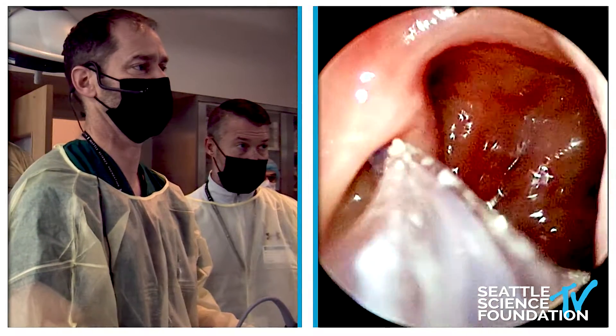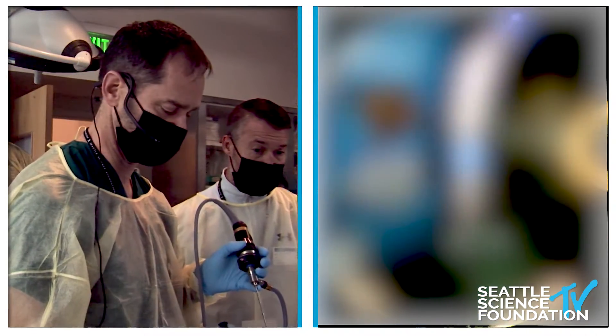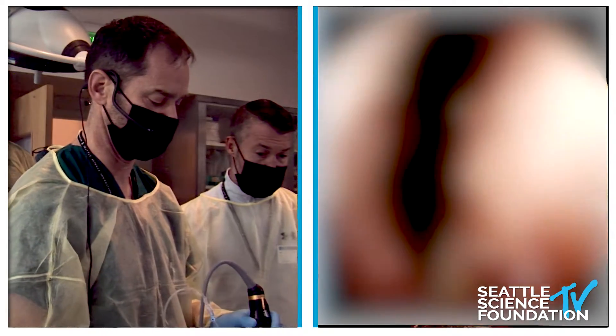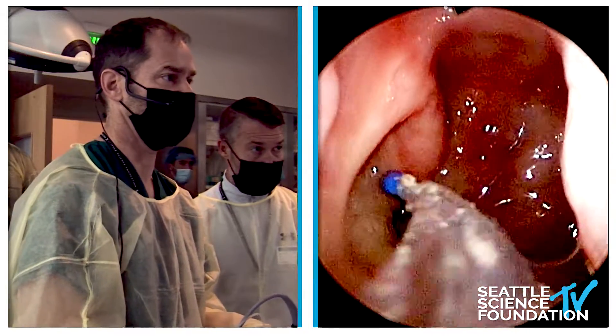This is just finding the eustachian tube, and this is the first time I have ever used this new one from Medtronic, which is kind of cool. It's a rigid balloon. I believe we have the Striker balloons here as well — Sonia, if we do, just give me the thumbs up — and you're welcome to try either one.